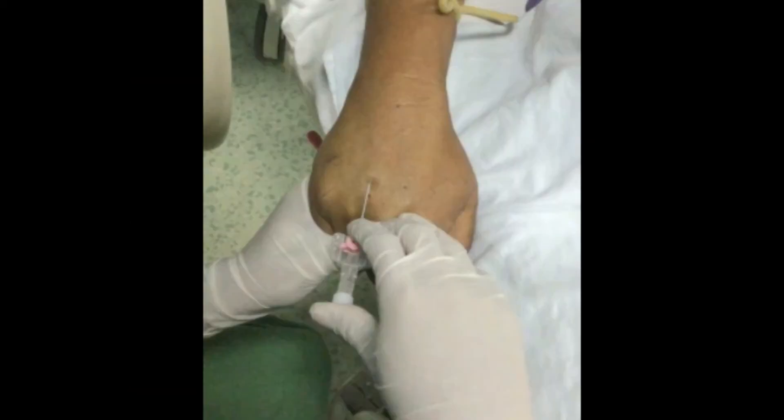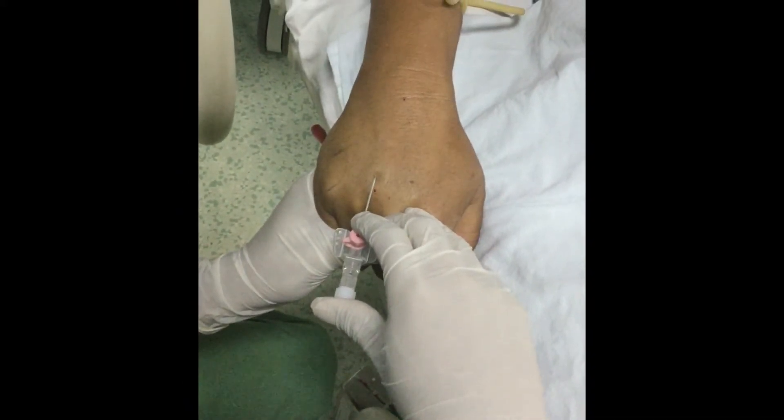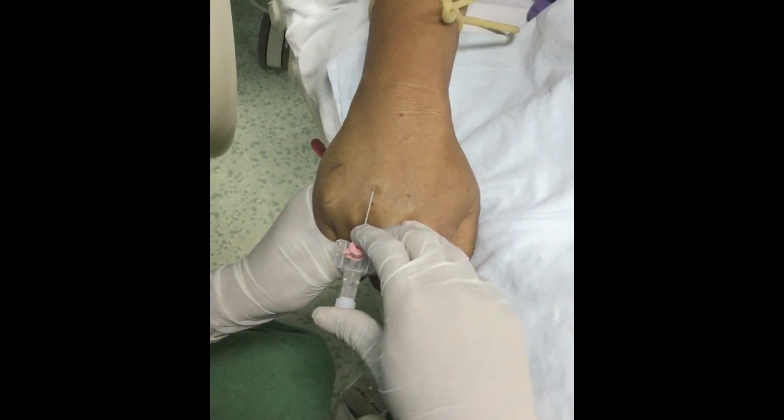Catch the catheter wing with the first and middle fingers of the dominant hand and support with the thumb of the same hand at the back of the cannula. Hold the needle bevel at an angle of 5 to 25 degrees depending on the depth of the vein.